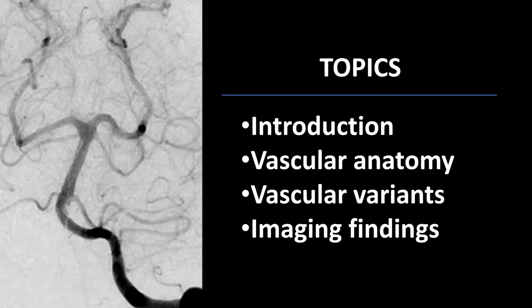A lot of attention is given to anterior circulation strokes because, especially since it has been proven in 2015 in the Big Five studies that endovascular thrombectomy for large vessel occlusions in the anterior circulation is a safe and effective procedure, something that has not been proven for posterior circulation strokes, and as a consequence, they tend to be a bit neglected. They definitely need to be discussed separately, because most of the things you'll find on, for instance, the role of perfusion-CT in ischemic stroke is focused on anterior circulation stroke, not on posterior circulation stroke.